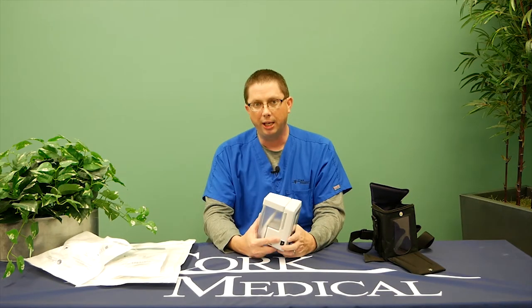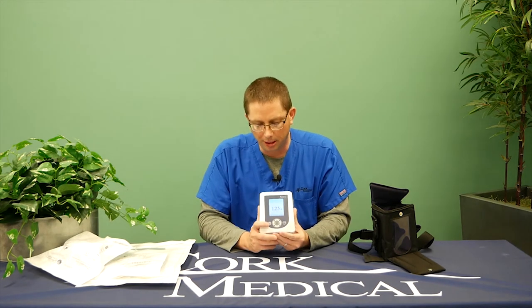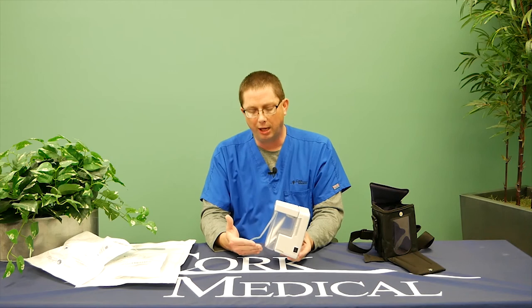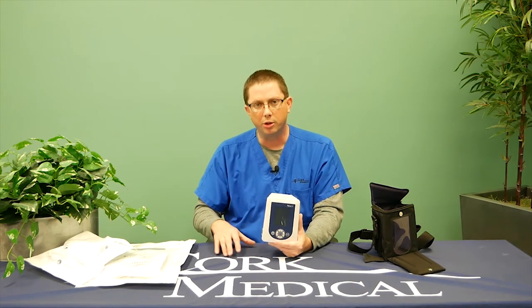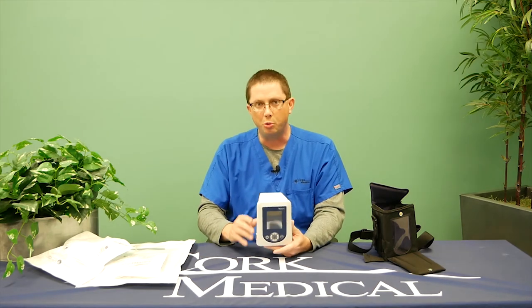If you notice your canister filling with frank red blood in a rapid manner, you need to immediately power off the pump. If you're able to reach your wound, apply pressure to the wound and call 911. It's normal to have a little Kool-Aid color or pinkish drainage. The main cautionary note is if the canister fills rapidly with bright red blood, power off the pump, hold pressure, and call 911. There is a risk of bleeding associated with negative pressure. Do not remove the dressing.